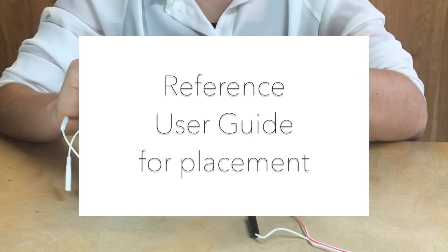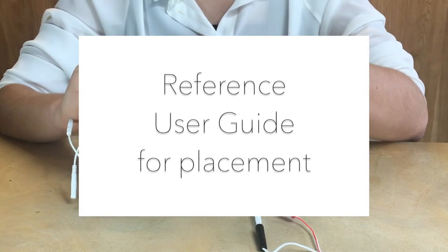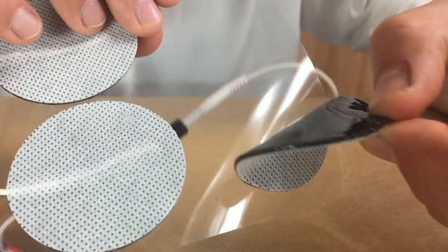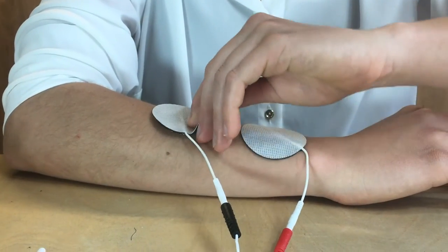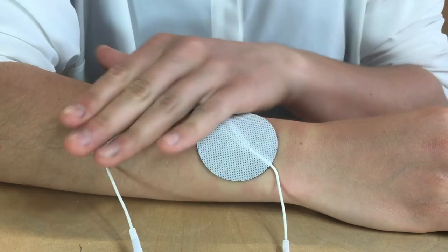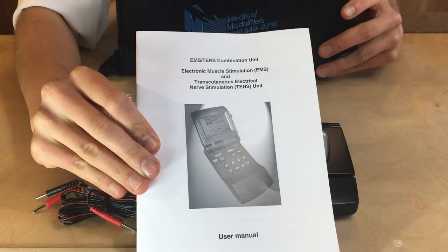In this example, we will demonstrate placement of electrodes on the forearm. Peel the electrode off the pad, placing it firmly on the skin, making sure it is adhered well. Place the second electrode in the corresponding position in the same way, referencing the user guide for placement locations.